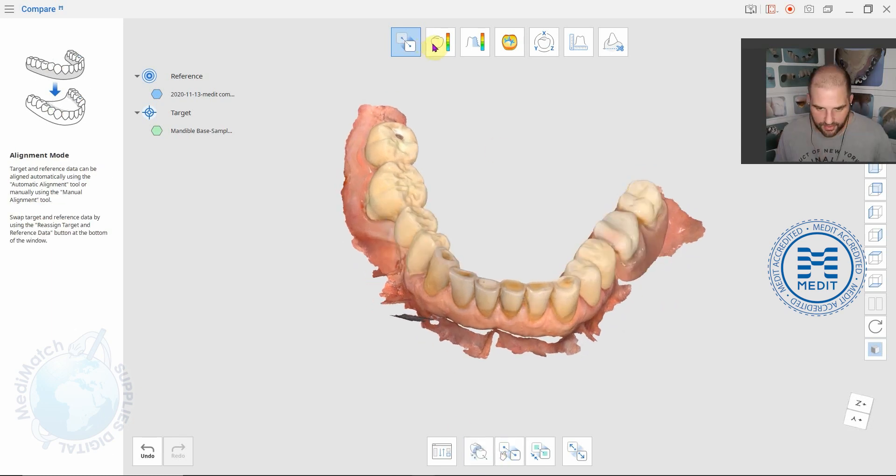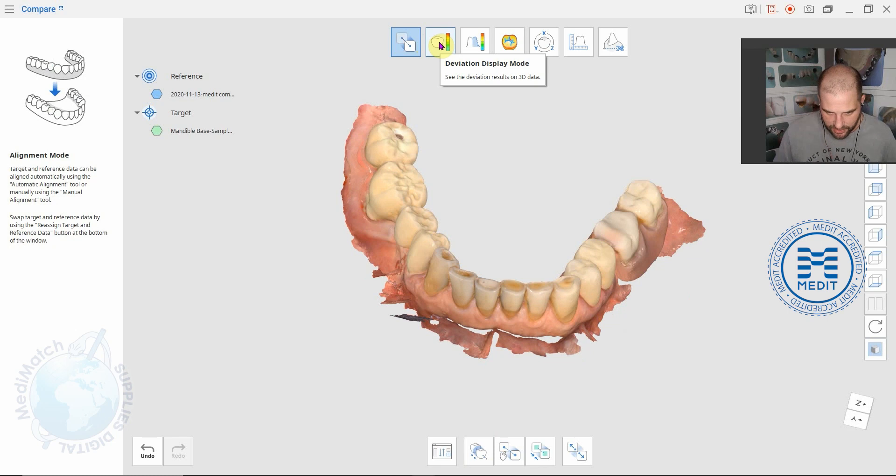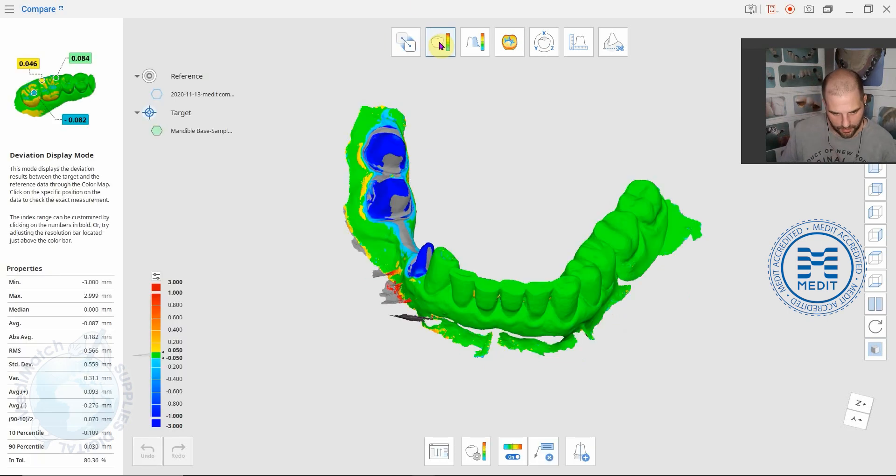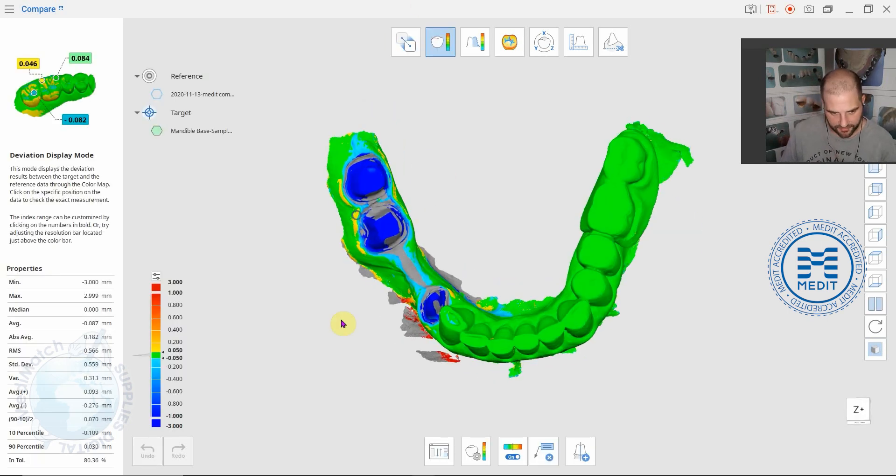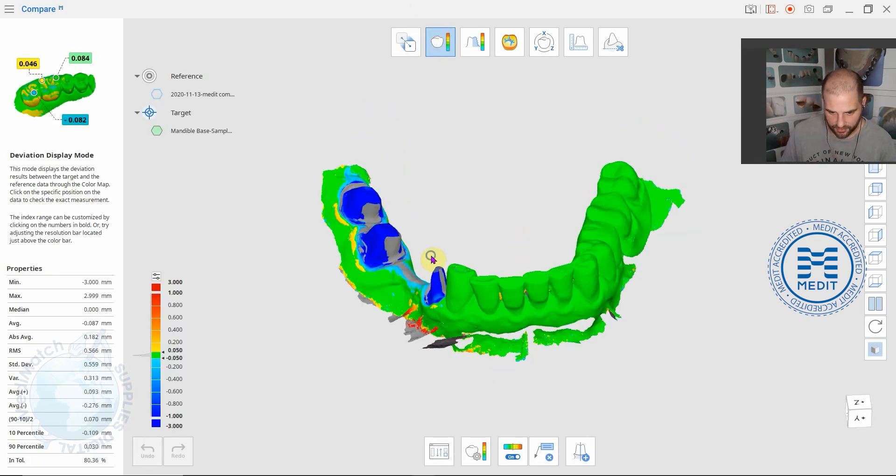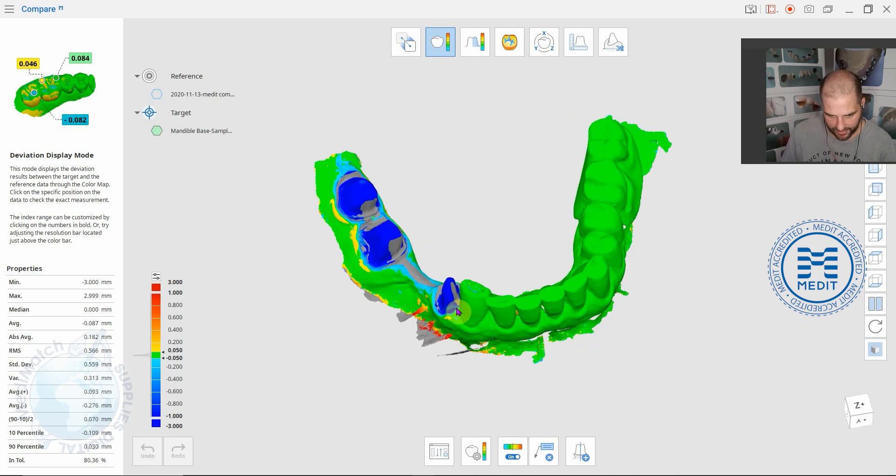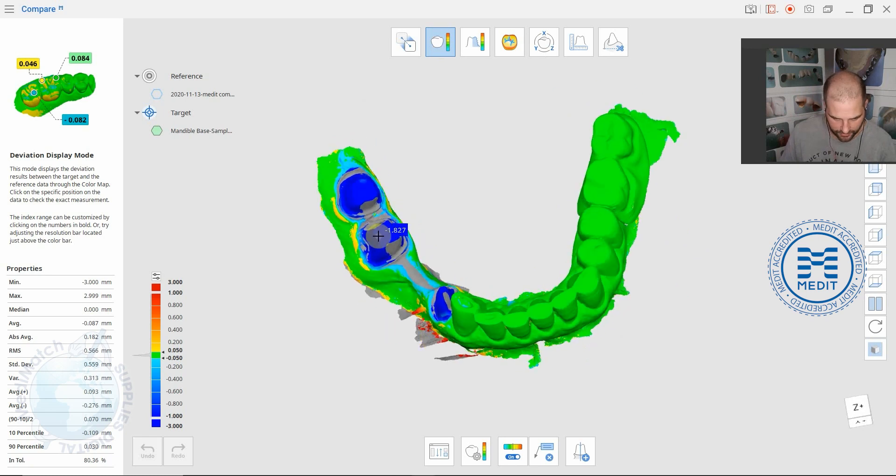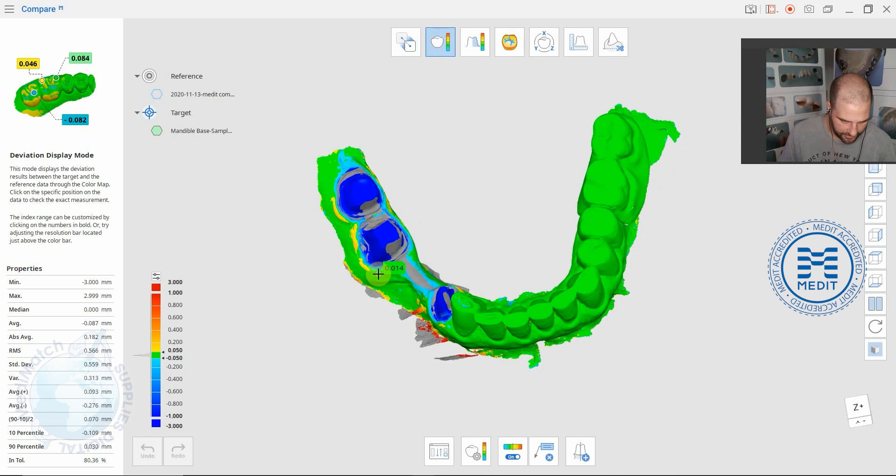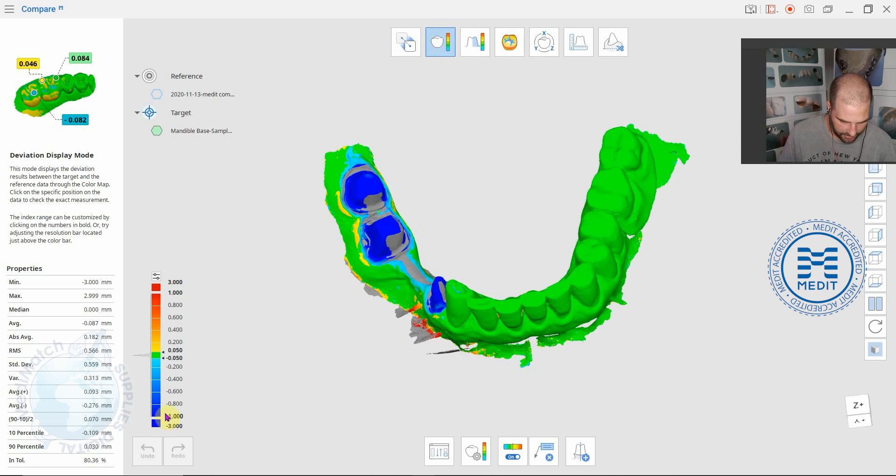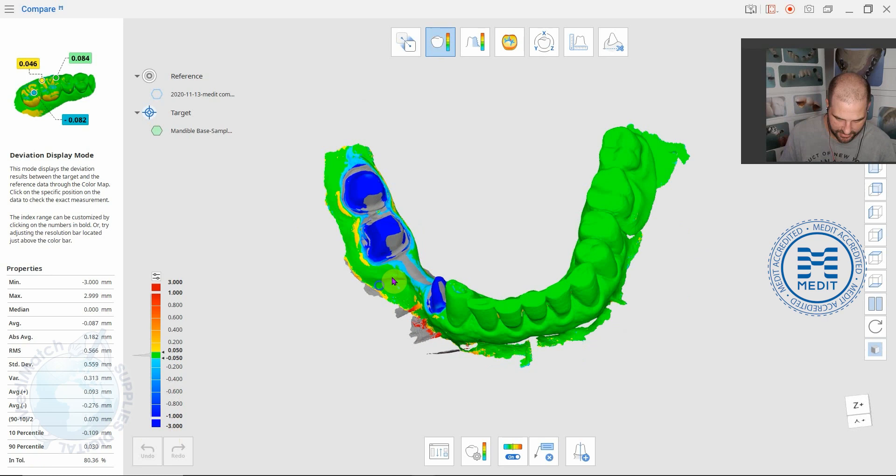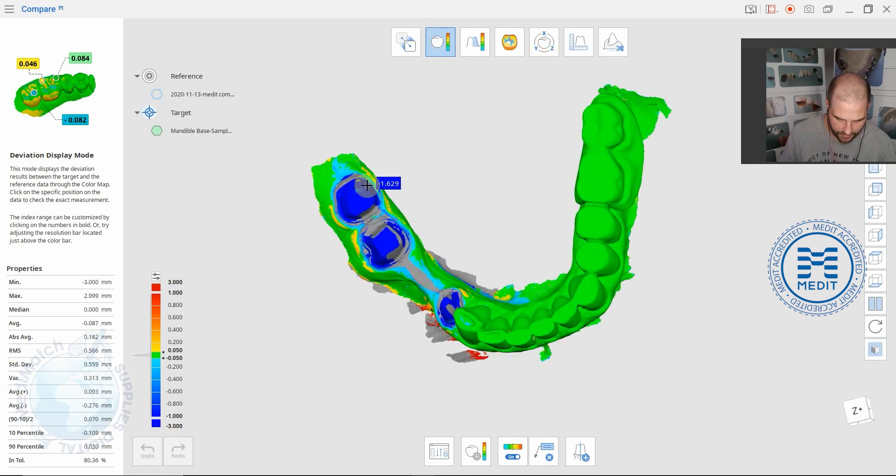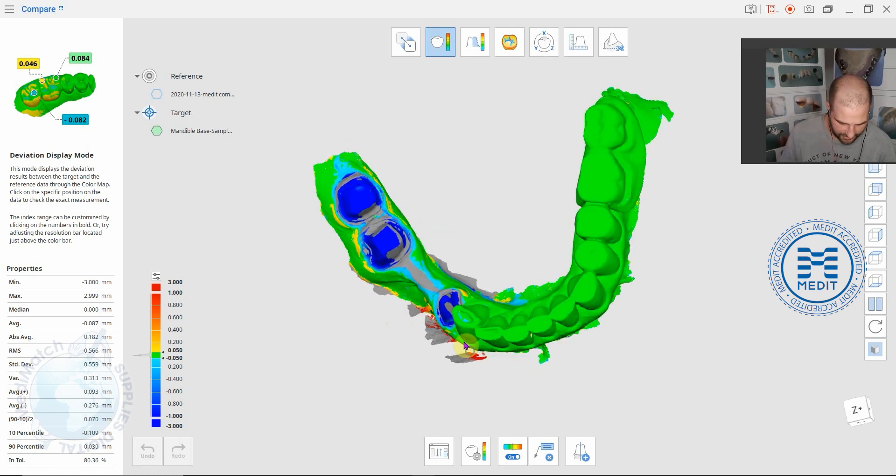If we click on this first icon up here, deviation display mode. This is showing you the difference between those two scans overlaid on each other. There's so much removed here that it's actually off the scale but you can see we are missing a lot of material, over 3 mm of material here. It's all blue. Where it's all green the data is exactly the same.